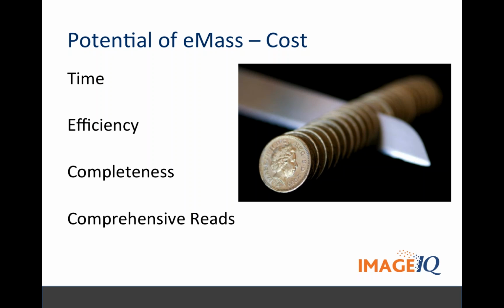So some of that was wasted space just for the trial itself, not just the software, but 30 minutes is all it took. Yeah, and the great added advantage of eMass is that you could put in test cases that you can do periodically during the trial. So if you had a bunch of readers on a trial, you put these test cases in, you get that visual audit trail for what these readers are doing. And if someone's out of sync with the rest of the readers, you can retrain them.